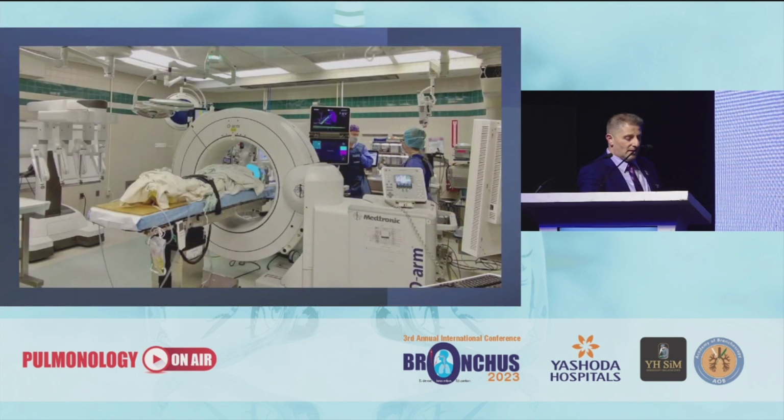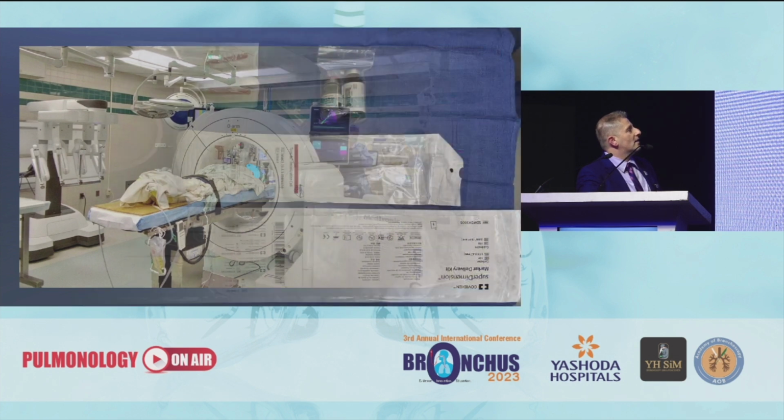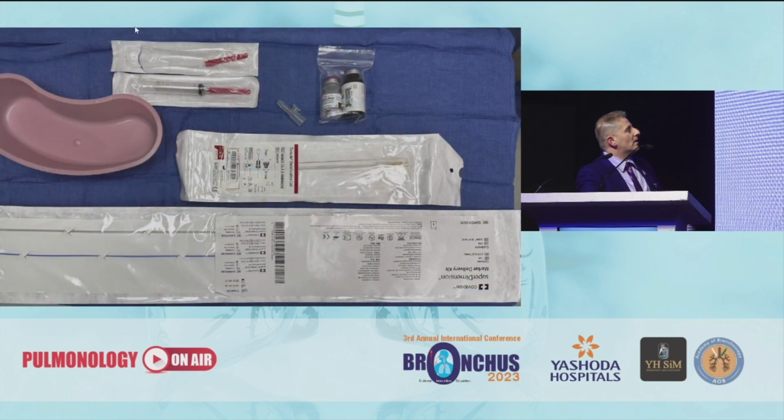This is after we started the case, and you can see the ion, and we have the catheter in the lesion there. After the spin, we confirm that we are in the area. After that, we use the Medtronic deploying device, also using the coil from Cook. In this case, we use a 7 by 3 millimeter coil.